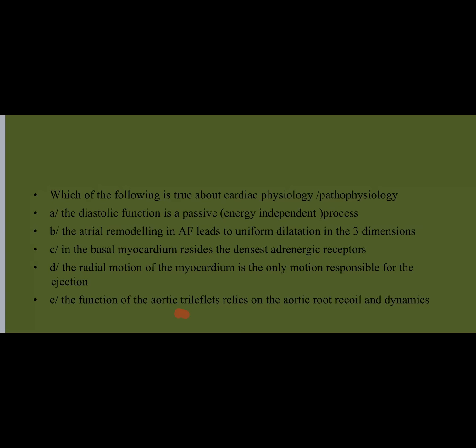The radial motion of the heart is the only motion responsible, and now we know. After the end of this lecture, I want you to go around talking about radial strain, circumferential strain, longitudinal strain, and twisting strain. So these are the 4 strains everybody is talking about. Even if you know them just as names, that's enough. But we have to know that radial contraction, which we check by echo as ejection fraction, is just one part of a complex set of cardiac mechanics. That's enough for me, okay? Now, what about this one?